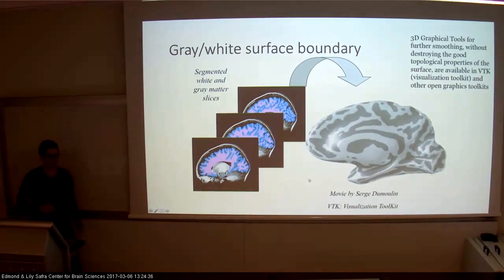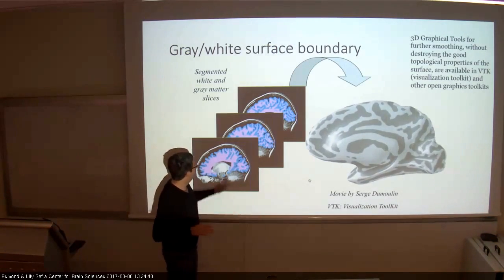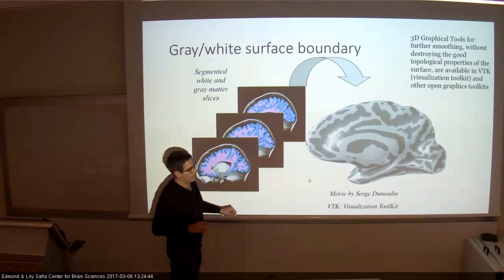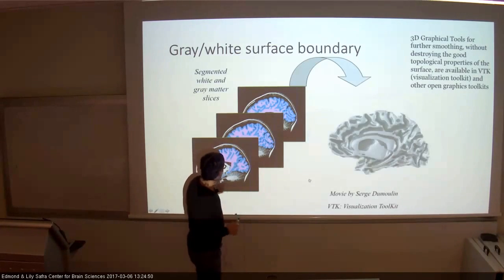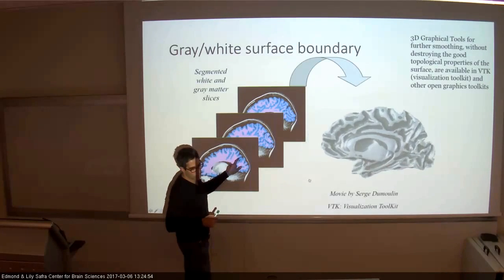But this is 2D that you make. 3D. So given that you have a 3D image, many slices, in all of them you have gray-white matter borders. You make sure that they're continuous. If there is a problem, you either automatically or manually fix it. And then you have the position of these vertices. I will show it more soon.